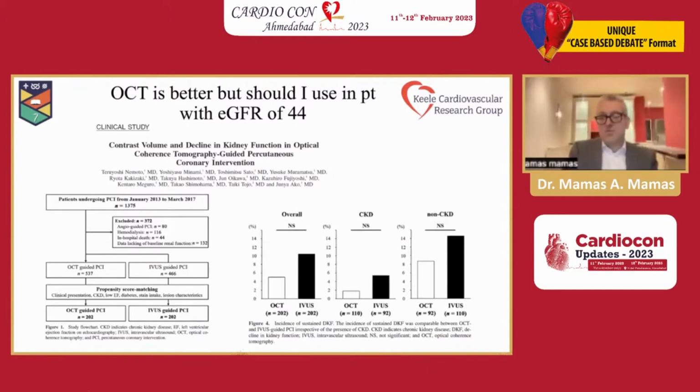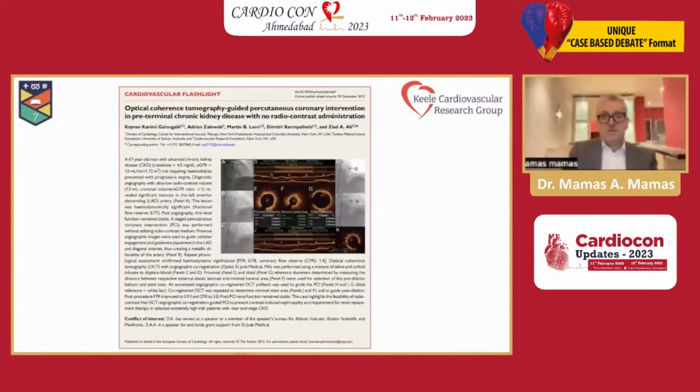In patients with much greater degrees of kidney dysfunction, I think it would be reasonable to use contrast-free OCT. So you could use saline with OCT, and you get good pictures and probably better imaging than you would with some of the IVUS probes, perhaps not with HD IVUS, but certainly Eagle Eye and so forth.